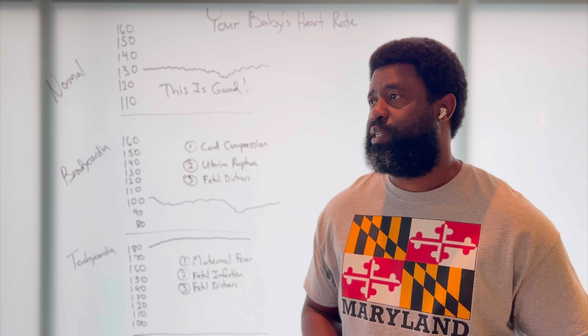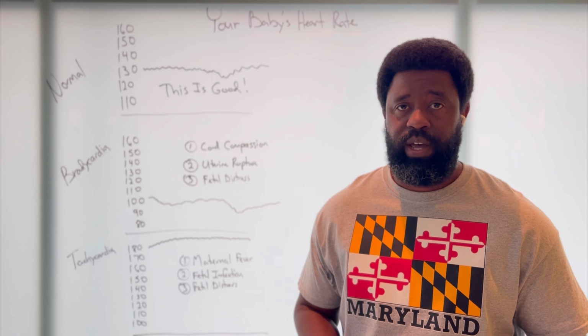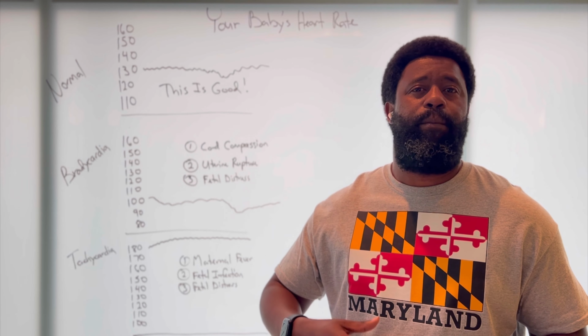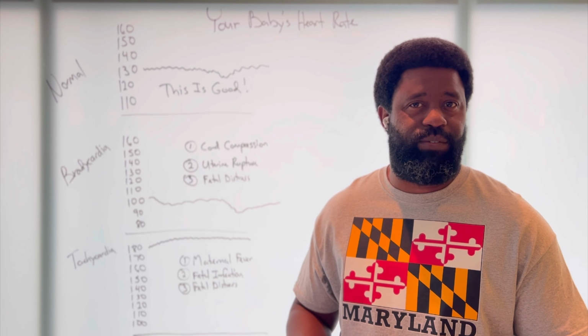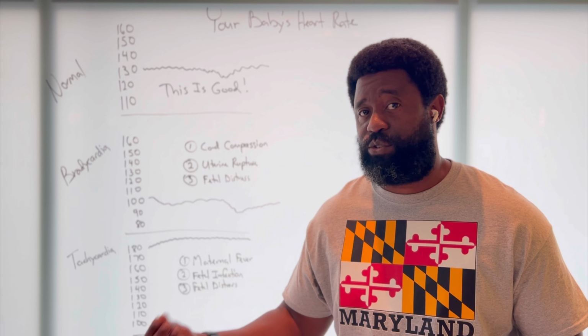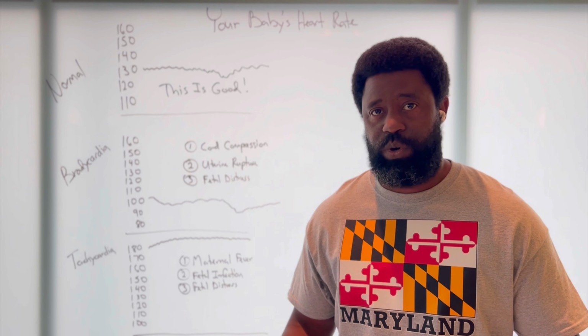Okay, so today we are going to discuss decoding your baby's heart rate during labor and delivery. This is a follow-up video to one I made a couple of days ago on the mother's contraction patterns, why contractions are important during labor and delivery, and how those contraction patterns will play out on the electronic fetal heart monitor.